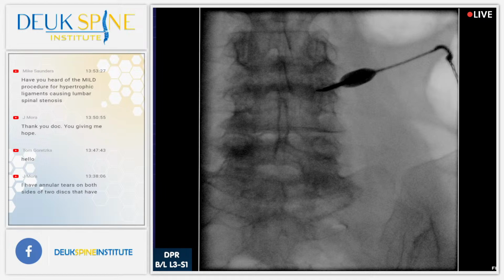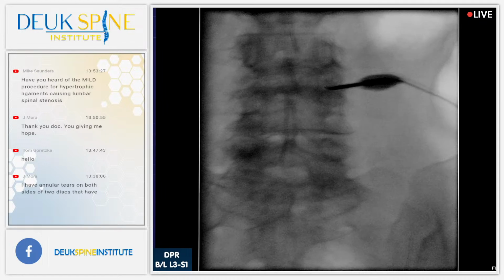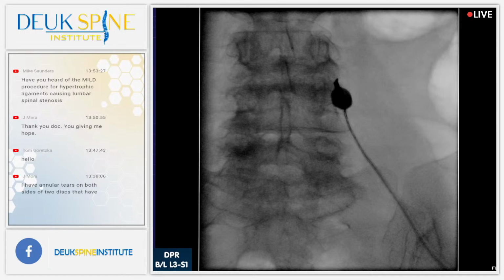Oh yeah, and the reason why it's tough too is because you've got fascia, which is the covering around the muscle. Shot. Once you poke through the fascia, you're kind of committed to go into that area. So I'm making a little fascial hole. Shot. It's too high. Shot.